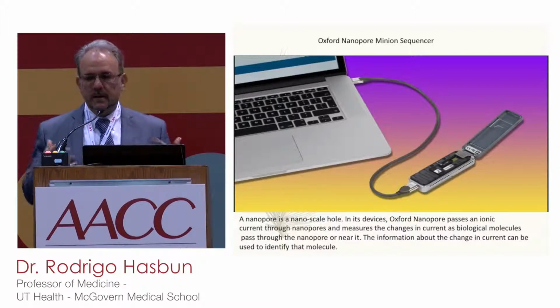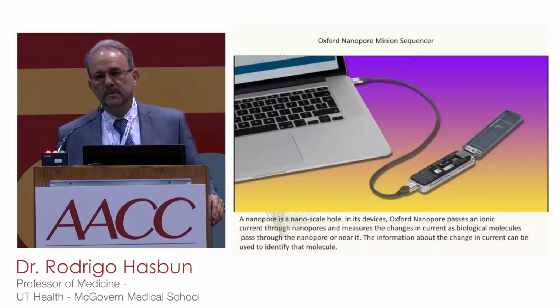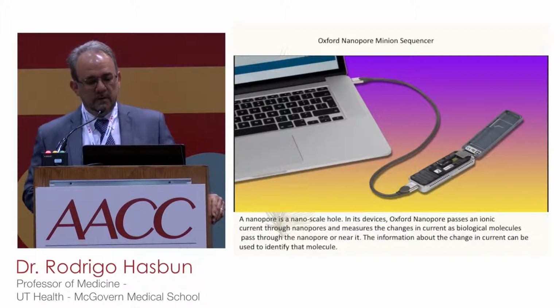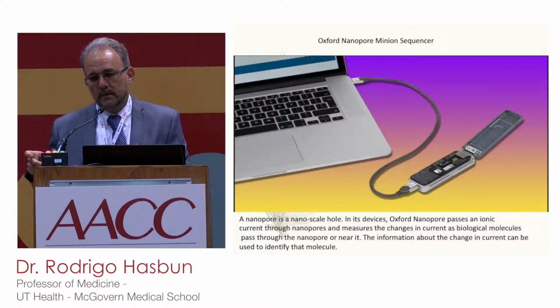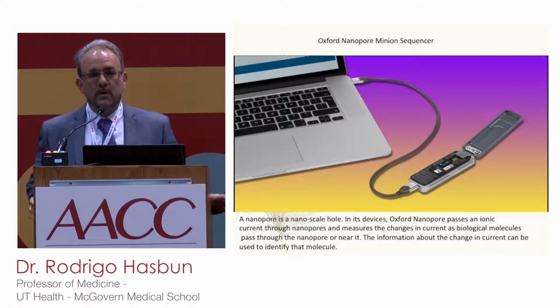And this is a metagenomic sequence you can do in your lab with just a very small, uncomplicated device like this. In the future, this is going to be connected to an iPhone, and you'll be able to do metagenomic sequencing anywhere, as long as you have Wi-Fi, and you can connect to the database of the NIH. So that's another technology that we're exploring right now.